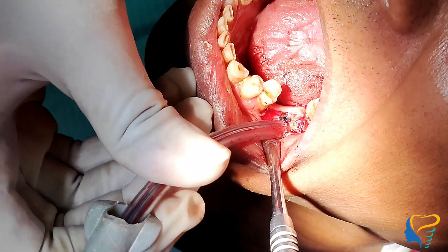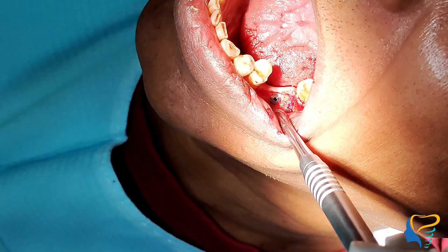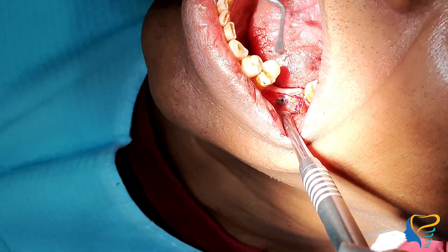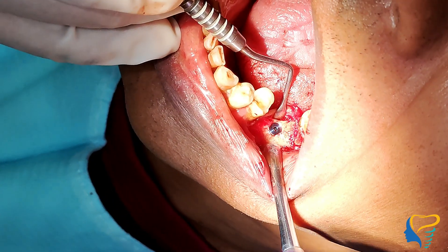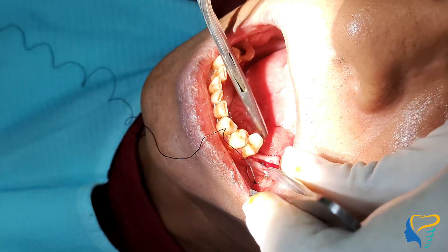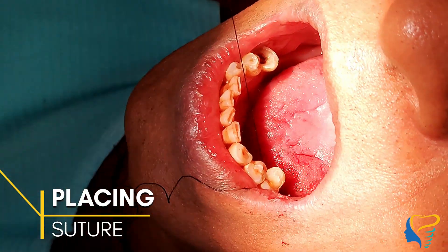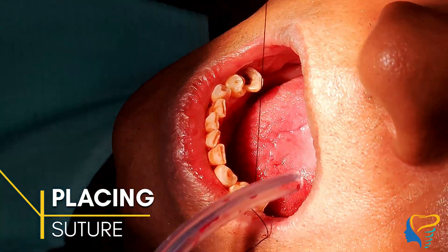One thing I forgot to mention is the implant torque — you can use the implant motor unit to measure it. I was confident enough with my hand distal pressure; the torque achieved is more than 45 Ncm.